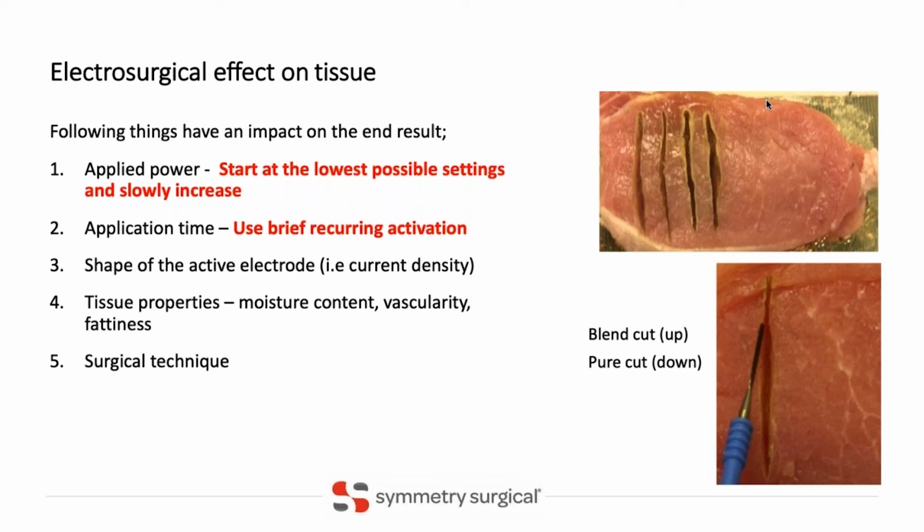Tissue properties will have an effect. What area are you operating? If there is more moisture, then you will probably need to use more power. And different doctors use different techniques. They're taught different ways of doing the same thing. So surgical technique also has a really big impact on the end result and how it looks on the tissue.